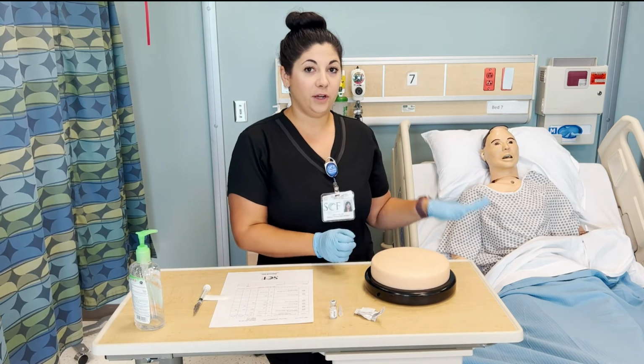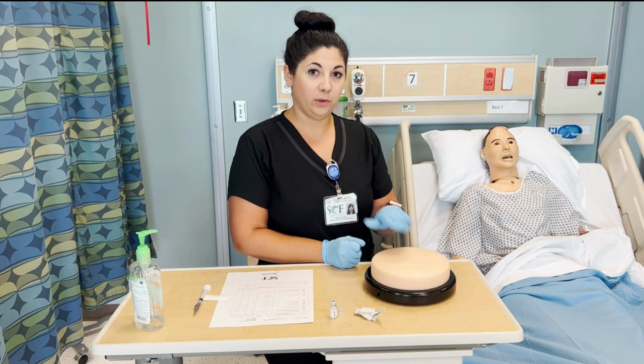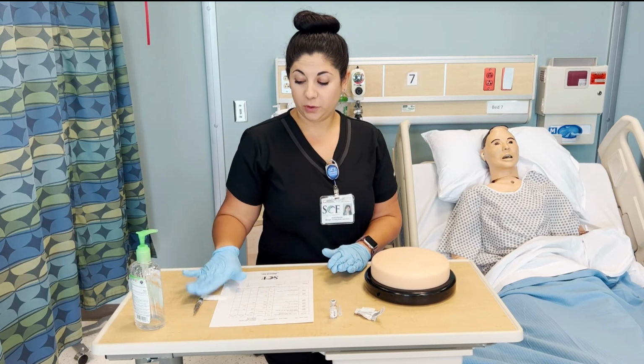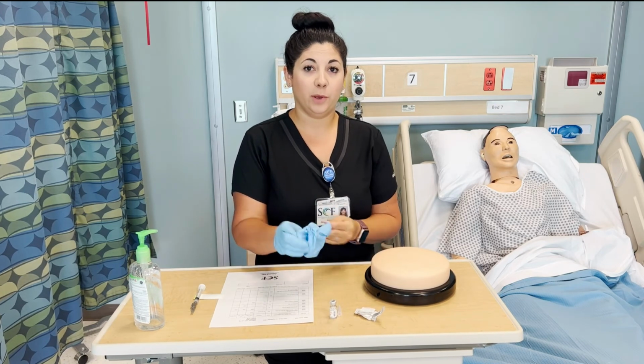I will then verify that my patient is okay. If there's any blood, I can dab it with a 2x2 or put on a Band-Aid. And I will dispose of my needle in the sharps container, wash my hands, and document my medication.